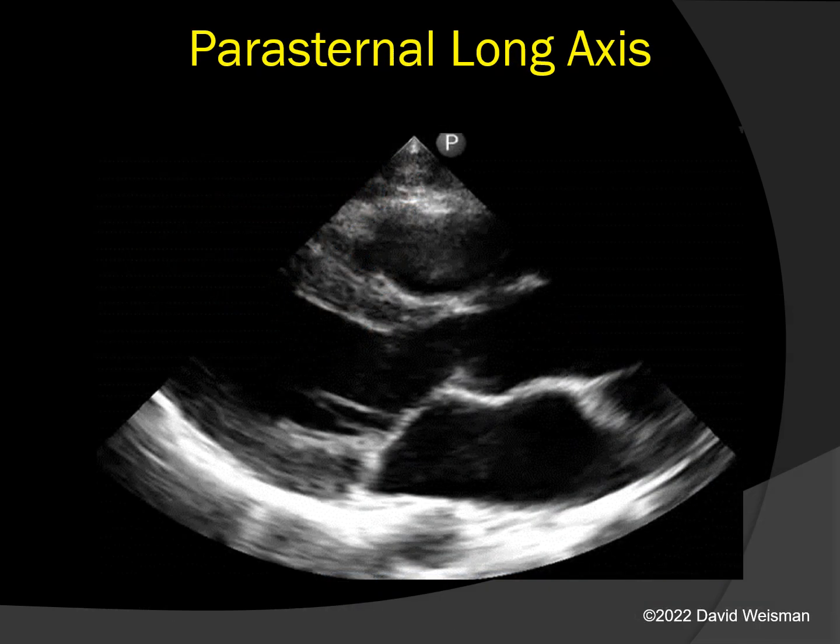We will once again identify the structures seen in this image. Here we have the right ventricular outflow tract. This is the right ventricular wall. This is the septum. This is the aorta. We will in a moment see the movement of the aortic valve pictured here.